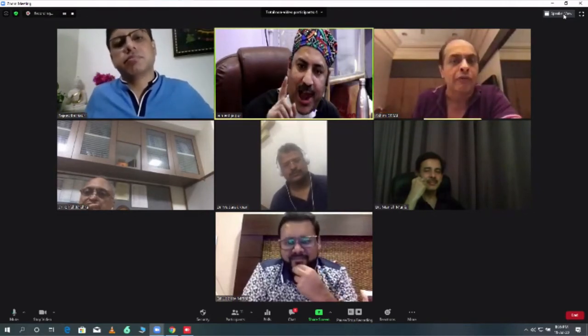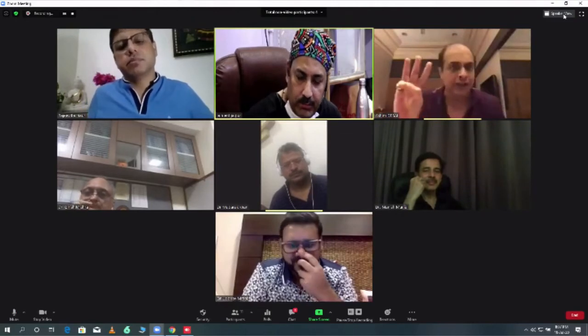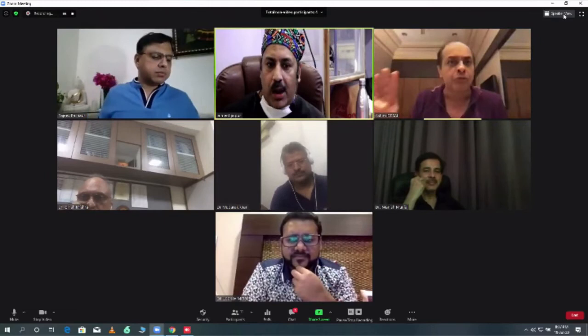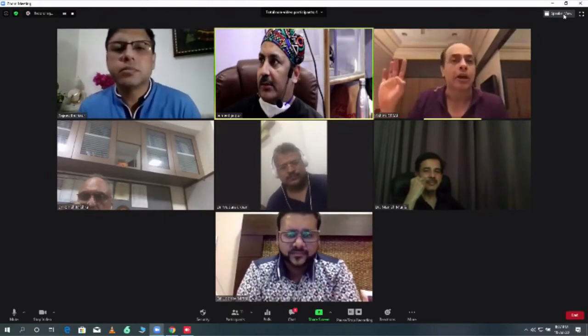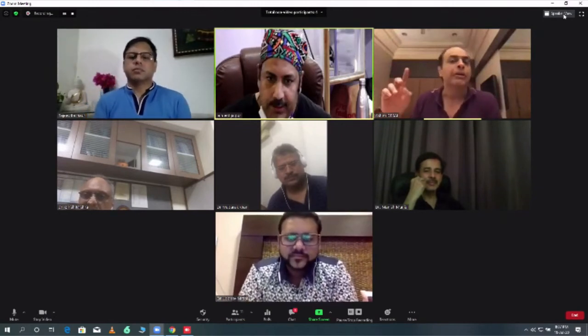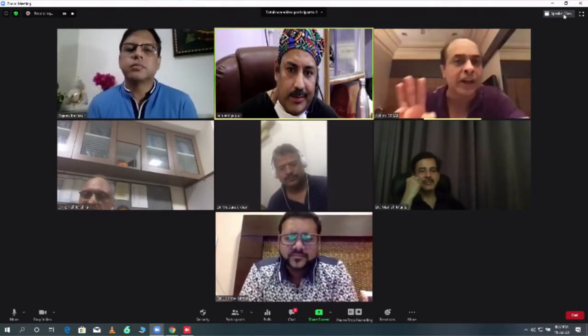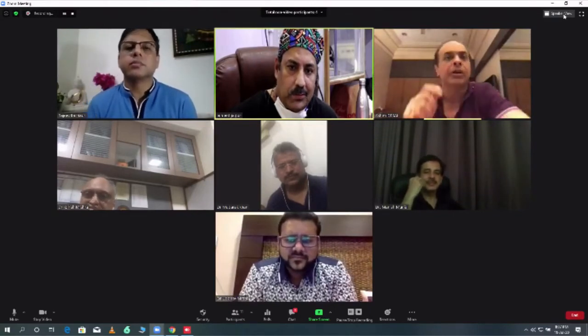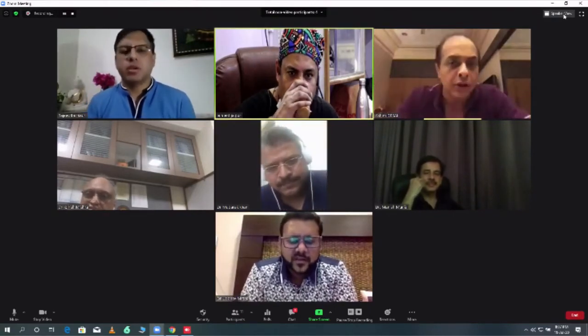Can I ask one thing? There have been three authors. One is Laske from Switzerland. The second is Saumil Merchant and Rosowski at the Harvard Institute. And the third is in the Netherlands. All three have shown that the wider the orifice, the fenestra, the better the transmission. Sorry, Satish, you were saying something.